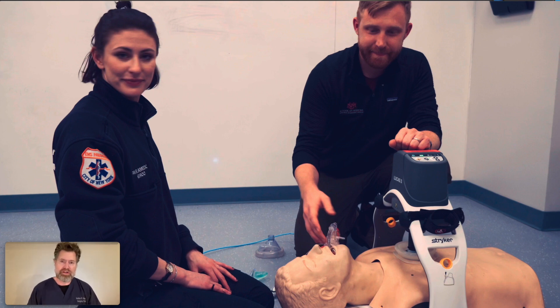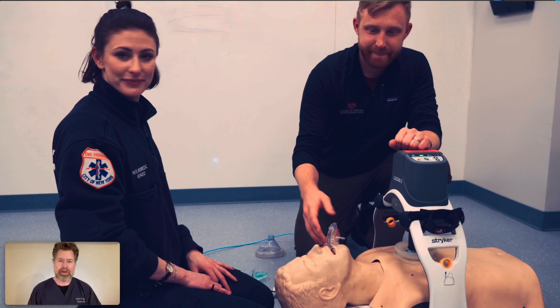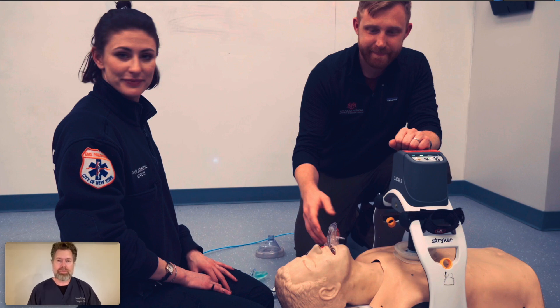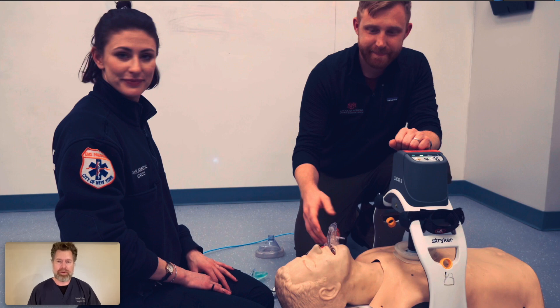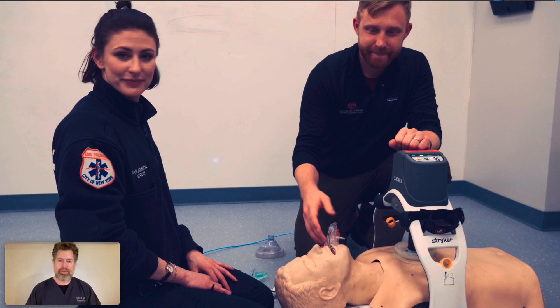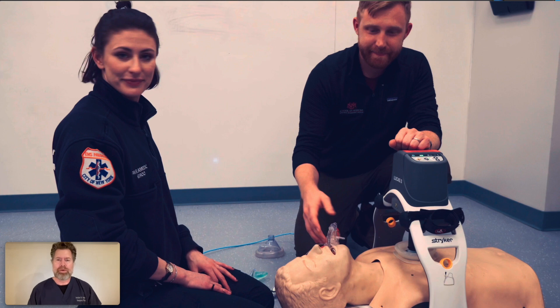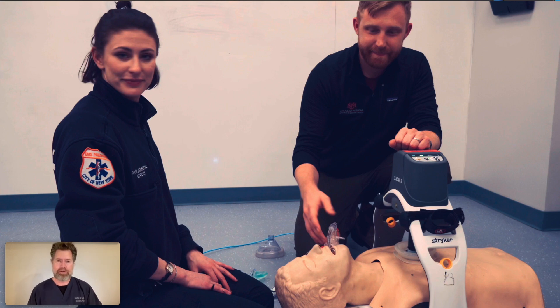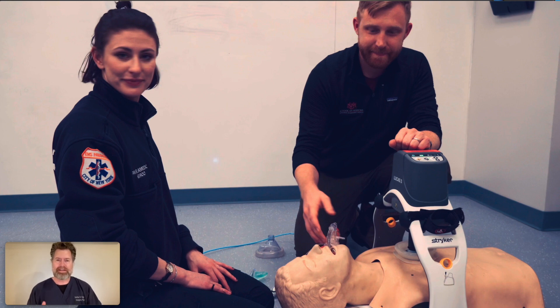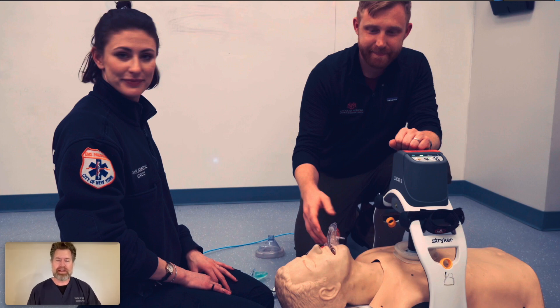What's more important — the tool I haven't mentioned yet — is the mechanical CPR device that's ongoing here. When doing hands-only CPR with people rotating on and off the chest, they don't have a perfect rhythm; they vary in depth and rate, and that makes it very hard to intubate. What's beautiful about the mechanical CPR, like the Lucas here, is that it provides very clear, rhythmic, consistent CPR in a way that allows you to more effectively intubate the patient.